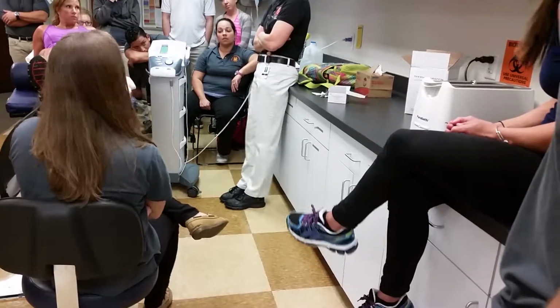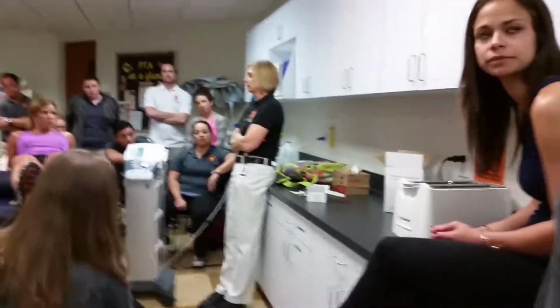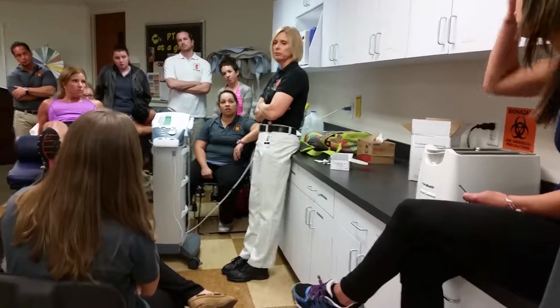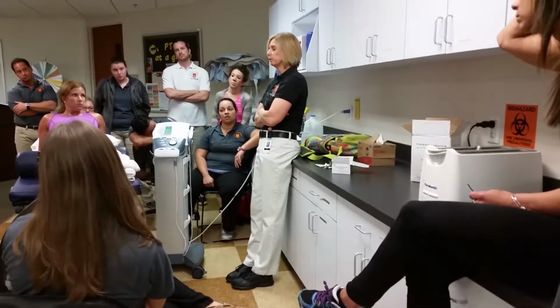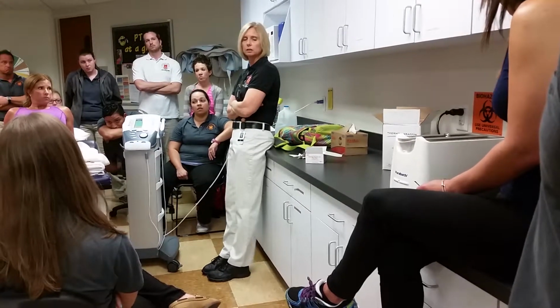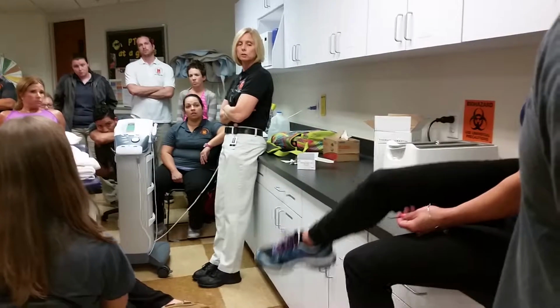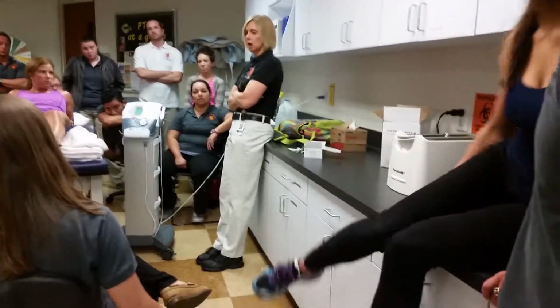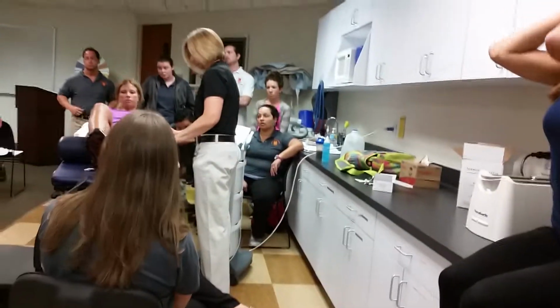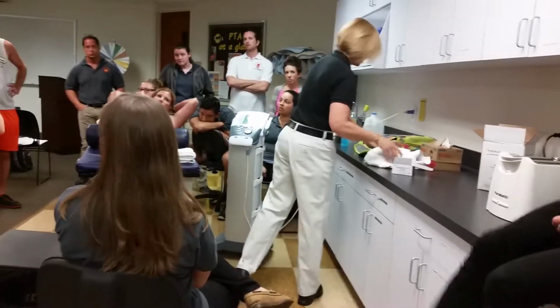Okay. Now the other thing you can do, which is kind of nice with the ultrasound, and you can do it with heat too, is position her so that you're stretching at the same time. So if I'm doing the iliotibial band, what position would that be? Think back to tests and measures. What position would that be? Side, but on the other side. Sidelying. Sidelying. Right? So I can have her sidelying. Does it have a name? Yeah, Ober. There you go.